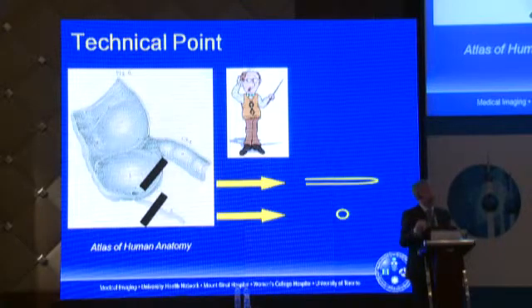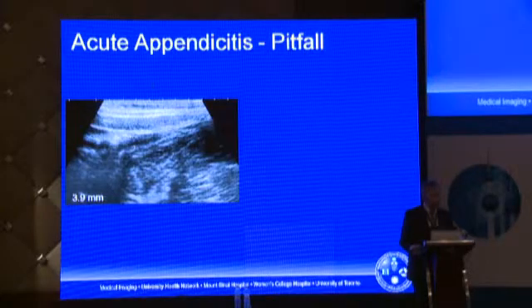So for me, when a technologist comes and says, you know, it's funny, I saw a normal appendix in sag, but I can't reproduce it in transverse, immediately the alarm bell should go off. And probably what was imaged was the edge of the cecum or ascending colon. And here's an example from overnight call where this was considered to be a normal appendix.